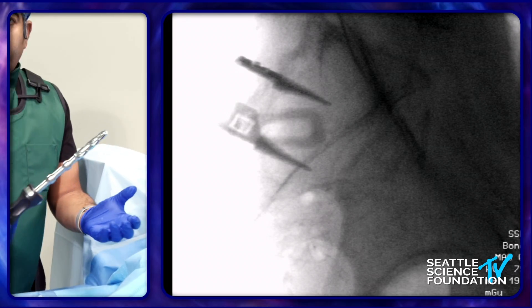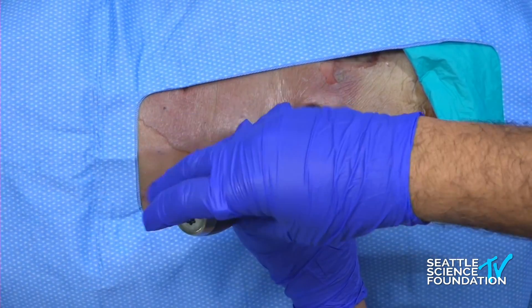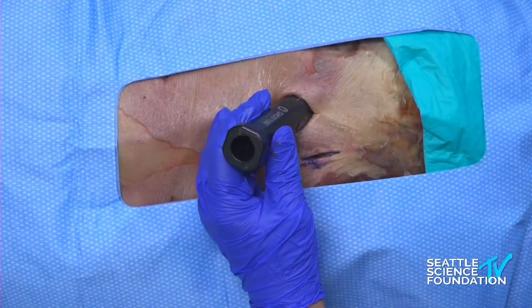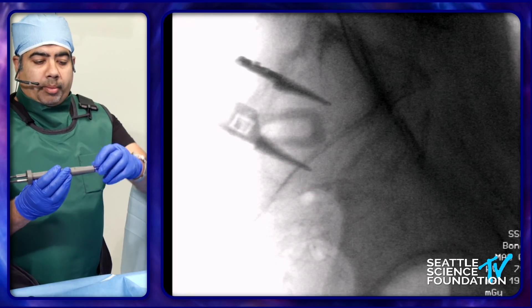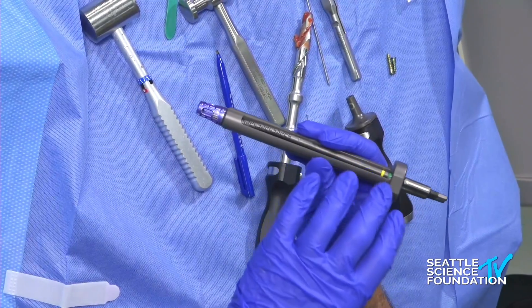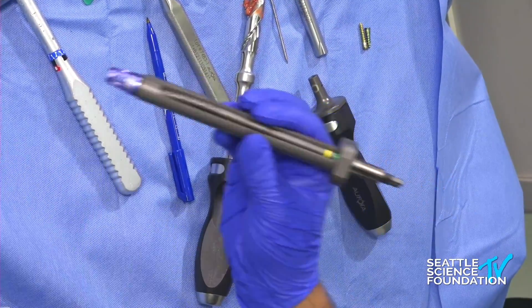The decortication principle is pretty much the same as what Ramo showed — you go ahead and take a couple of turns and ream some of the bone out. The next step is your tech will get your implants ready. If you want to zoom in: the implant is filled with bone graft, and the screws used for transfixation are part of that entire system — I'll show you how they're deployed.